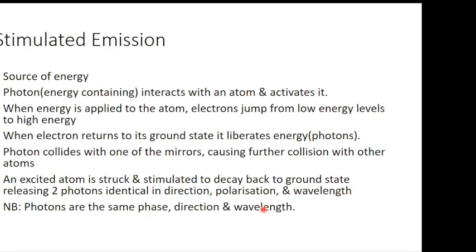I hope you understand that it's a closed system, if I may put it that way. Electrons get excited, they go to an excited state.